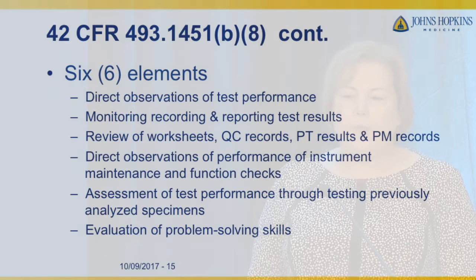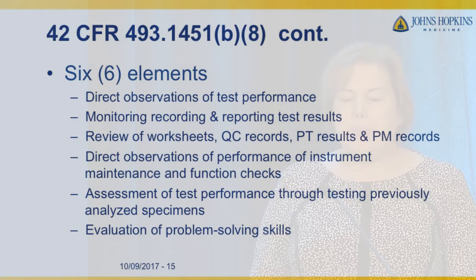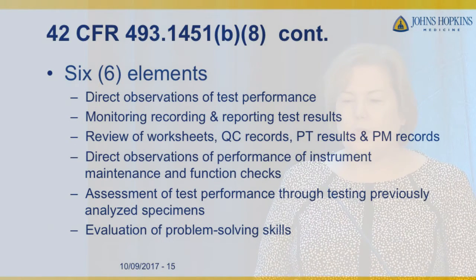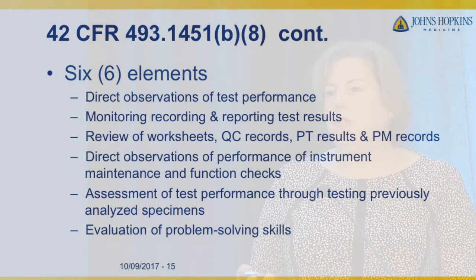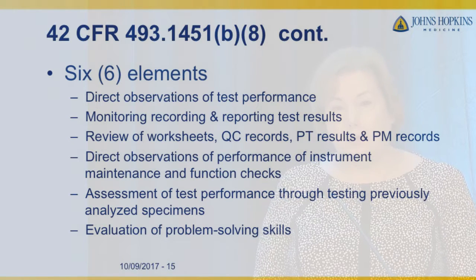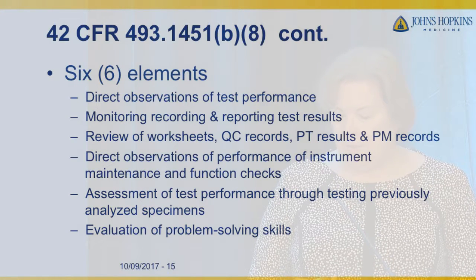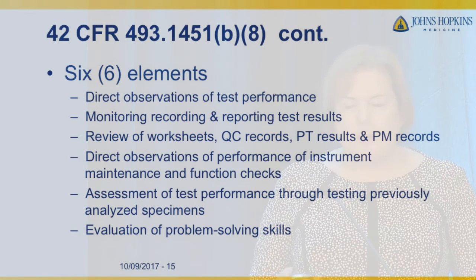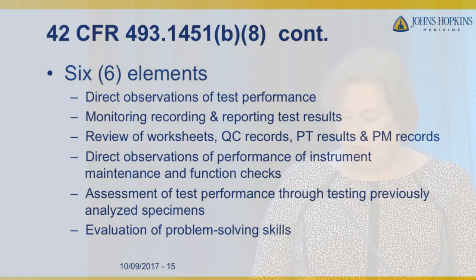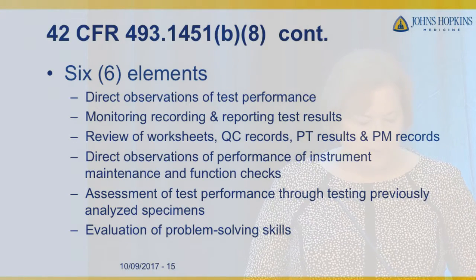Direct observation of performance of instrument maintenance and function checks. That one gets missed a lot. Assessment of test performance through testing previously analyzed specimens. You can make up your own specimens. You can use PT specimens once you've submitted the results to the body that you purchased the materials from, not before. And evaluation of problem-solving skills. So again, I'm just pointing these out, and then Lorraine's going to bring it home, so to speak, and show you how we've implemented some of this at JHH.